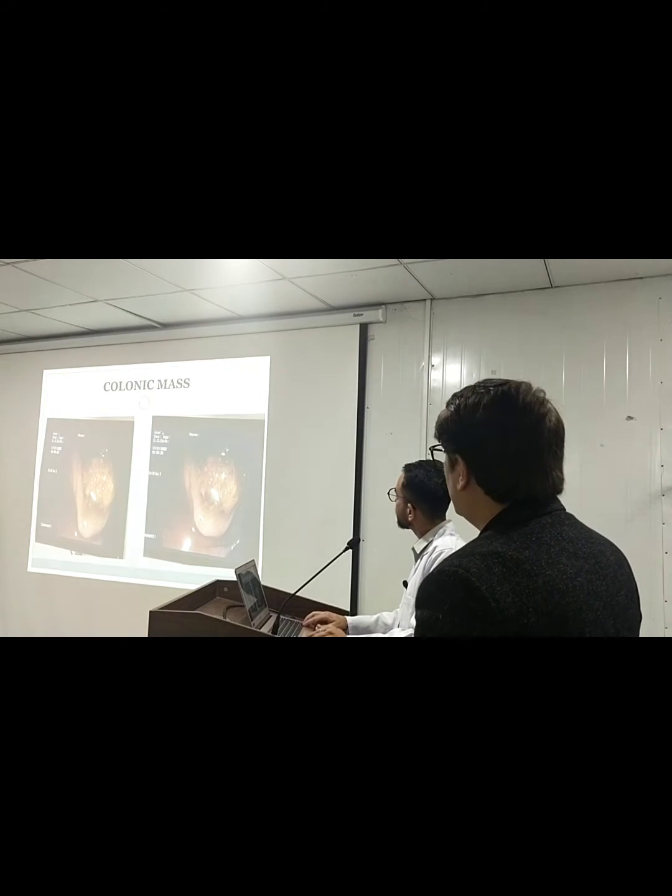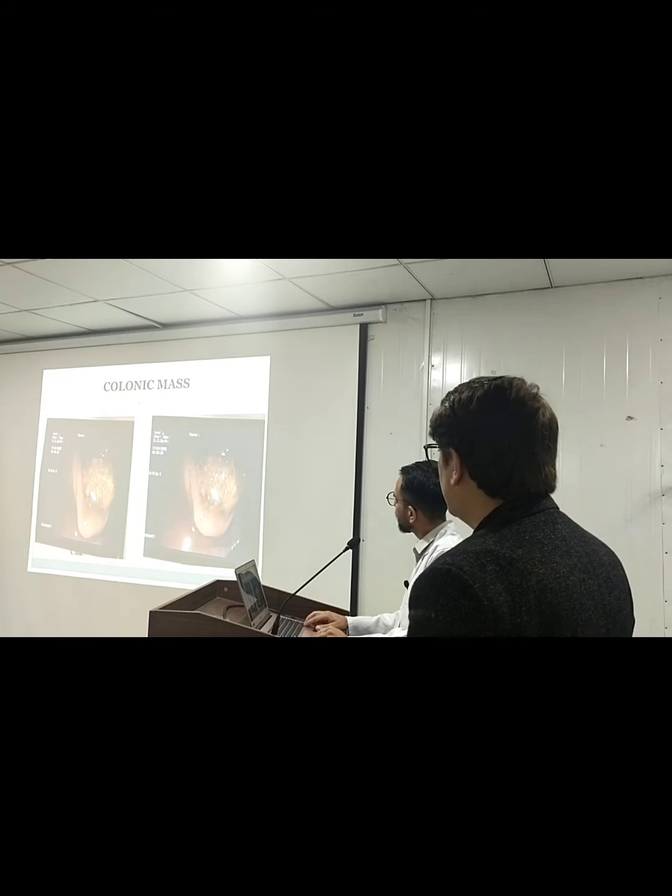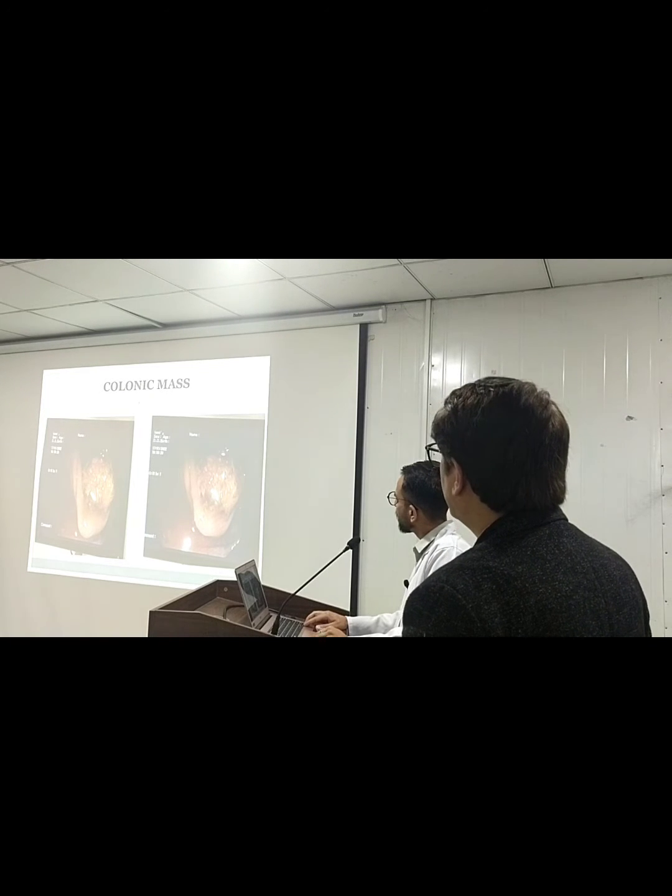Colonic mass. You can appreciate it is a whole mass involving the colon. It was a lady, almost 55 years old, with weight loss, anorexia and chronic constipation. So we did her colonoscopy, and this mass later on biopsy turned out to be a malignant adenocarcinoma.